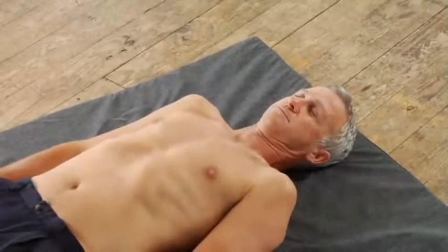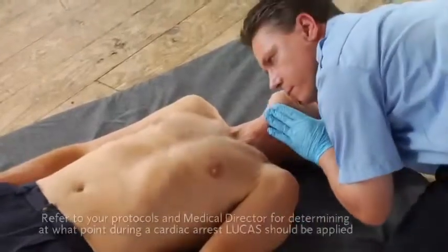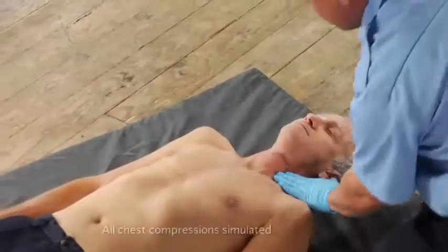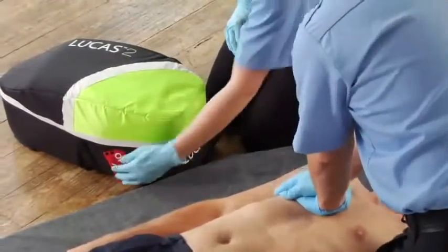Let's go over the operation steps in detail. Just like with manual CPR, when you arrive at the patient, confirm cardiac arrest and start CPR according to your protocols. If someone is already doing manual compressions, offer to relieve them. Now get out Lucas. Put the backpack down with the top towards you and open the bag.